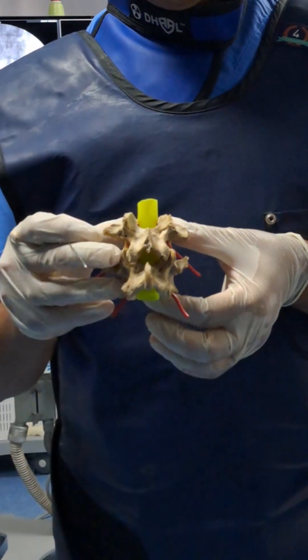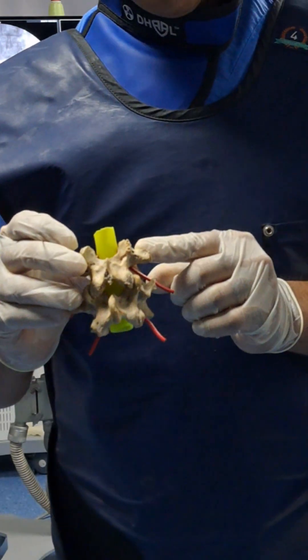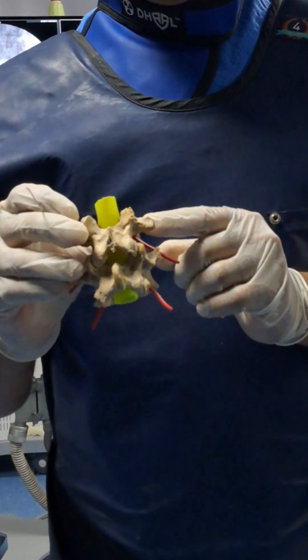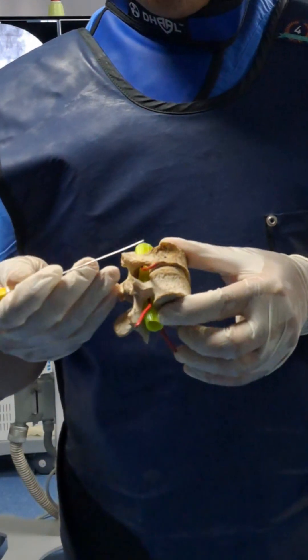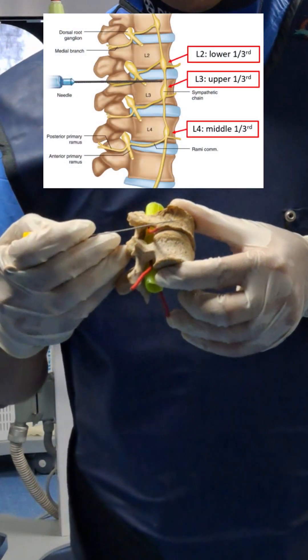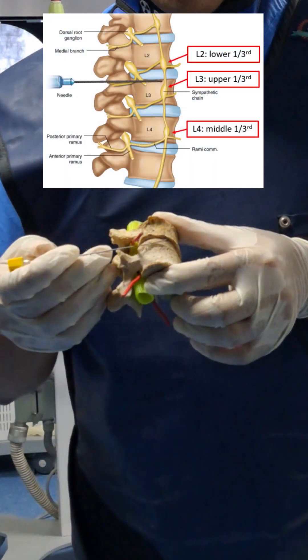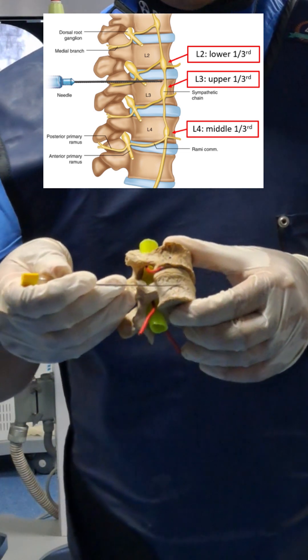First is your AP view, then squaring of the L2 vertebra. The procedure is done at the level of L2, L3, and L4. For L2, I will keep the needle at the lower one-third; for L3, at the upper one-third; and for L4, the needle will be at the middle of the body.